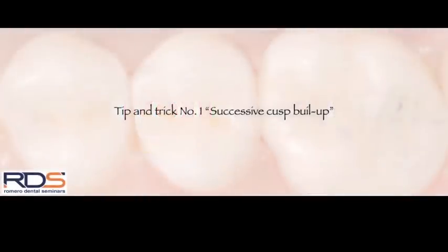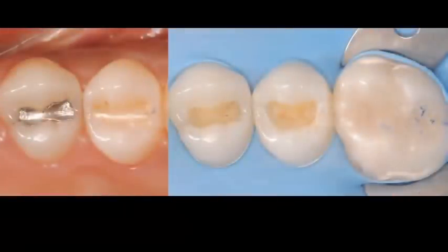So let's get started with our tip and trick number 1. I'm going to share with you this concept called the successive cusp buildup technique. I'm sorry, I'm missing a D right here, but I will edit that at the end of my presentation. This is going to be a very clinical webinar, so I'm going to share with you a lot of clinical cases with a lot of, I believe, very valuable clinical information. And I want to remind everybody today that we are talking about lifelike posterior composites.